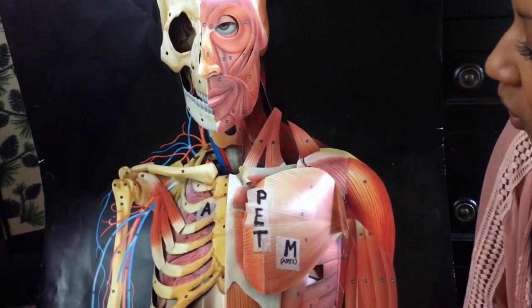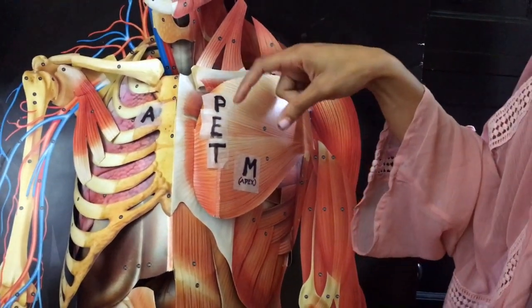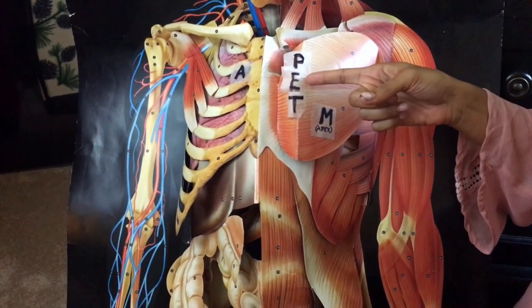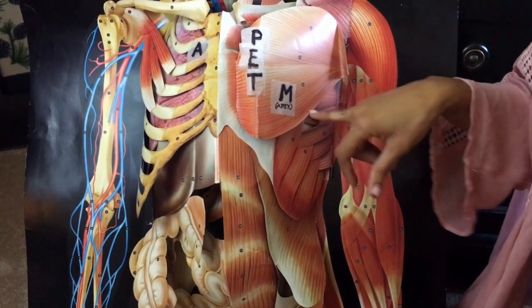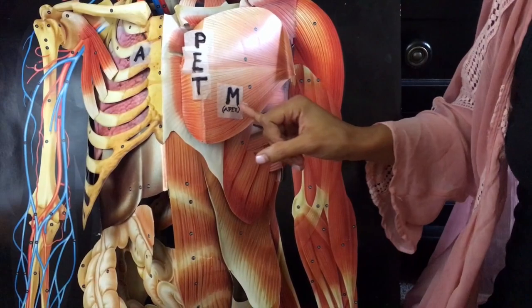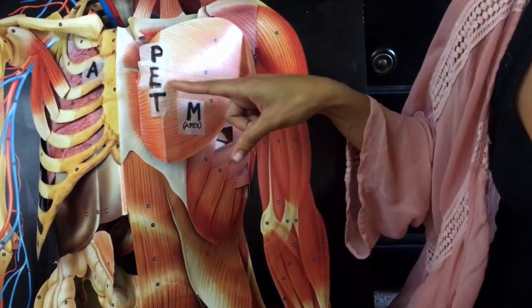A common mnemonic used to help memorize those landmarks is APE to MAN. The aortic valve can best be heard to the right of the sternum at the second intercostal space. The pulmonic valve can best be heard to the left of the sternal border in the second intercostal space. Erb's point is where you can actually hear S1 and S2 — if you're doing a quick assessment, that's the best place, at the left of the sternal border in the third intercostal space. The tricuspid valve is best auscultated to the left of the sternal border in the fourth intercostal space. And the mitral valve can best be heard in the fifth intercostal space, mid-clavicular — you locate the clavicle, estimate the middle, and go down to that fifth intercostal space. You can hear both S1 and S2 there.